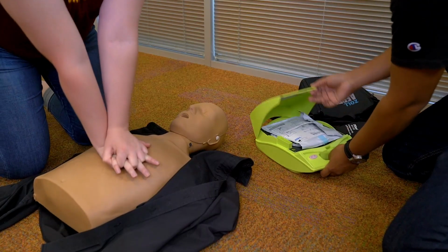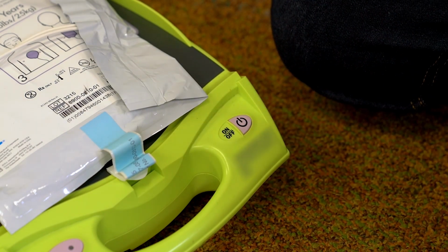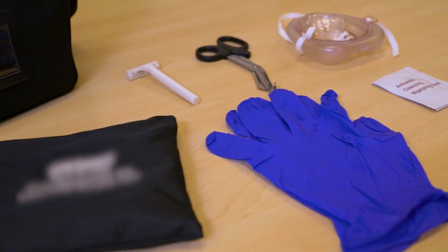Next, lift the AED lid and turn on the device. While providing chest compressions, listen carefully to automatic prompts given by the AED. Wear gloves if possible. Shears and gloves are in the AED kit.